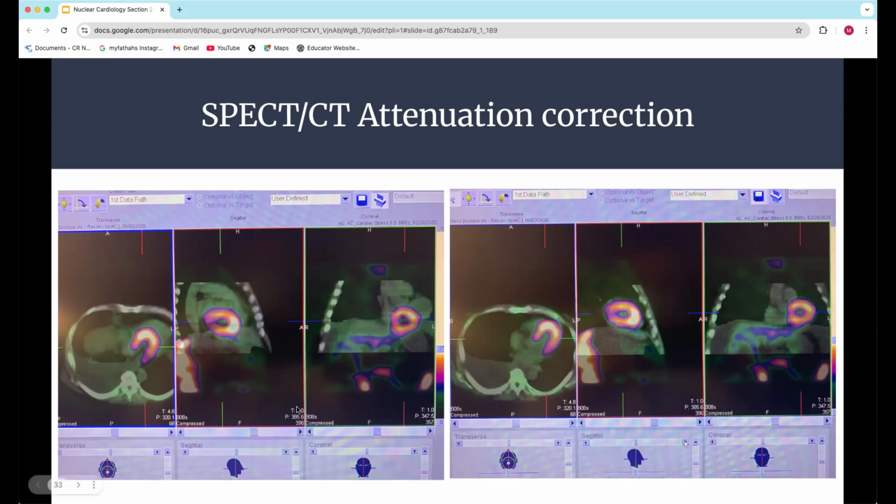So what I did is I moved this one on the left out of place, ridiculous. Like here's the CT of the heart right up here, and I moved the perfusion way out. You'll probably never get something that the computer brings up quite this bad, but I have seen some gnarly ones. So again, you're going to want to move this perfusion right over the CT. This will move up, this is going to move kind of to the lateral, and it'll probably move a little anterior. And that's what I've done on the second set of images. And you can see that they're lined up much better.